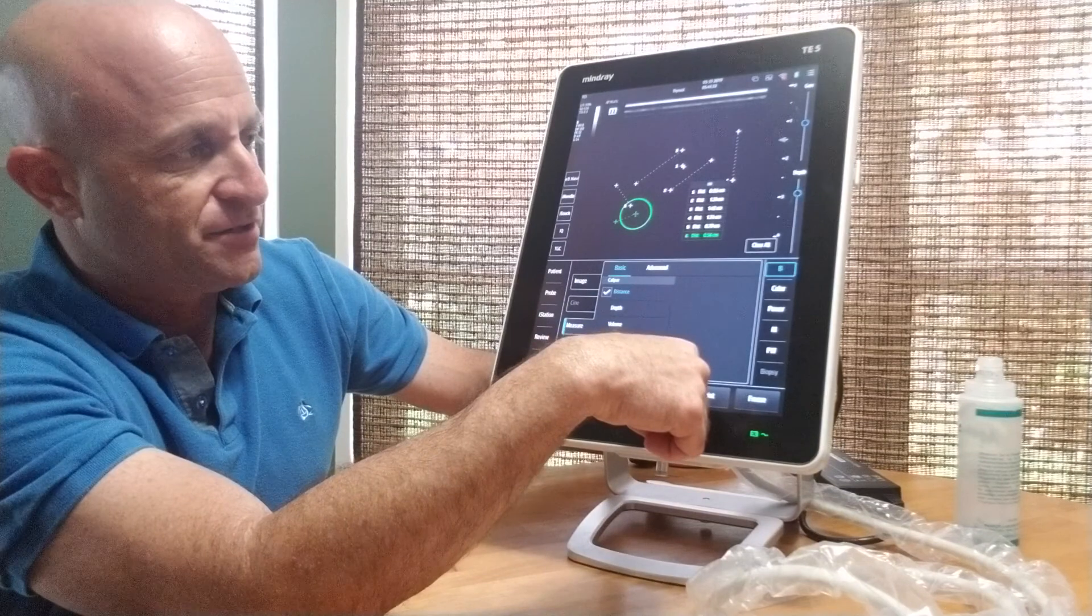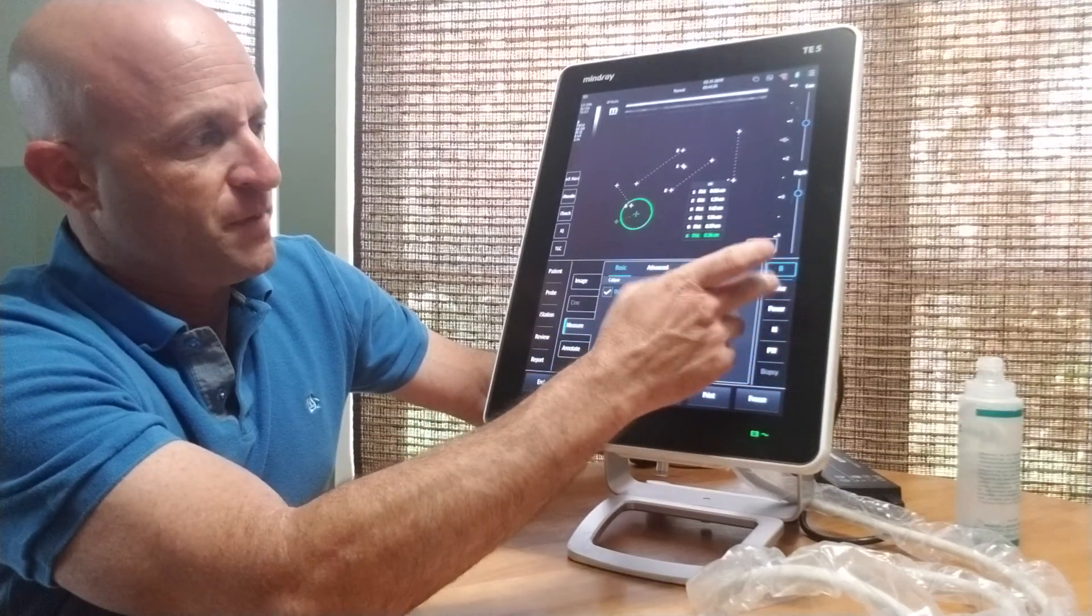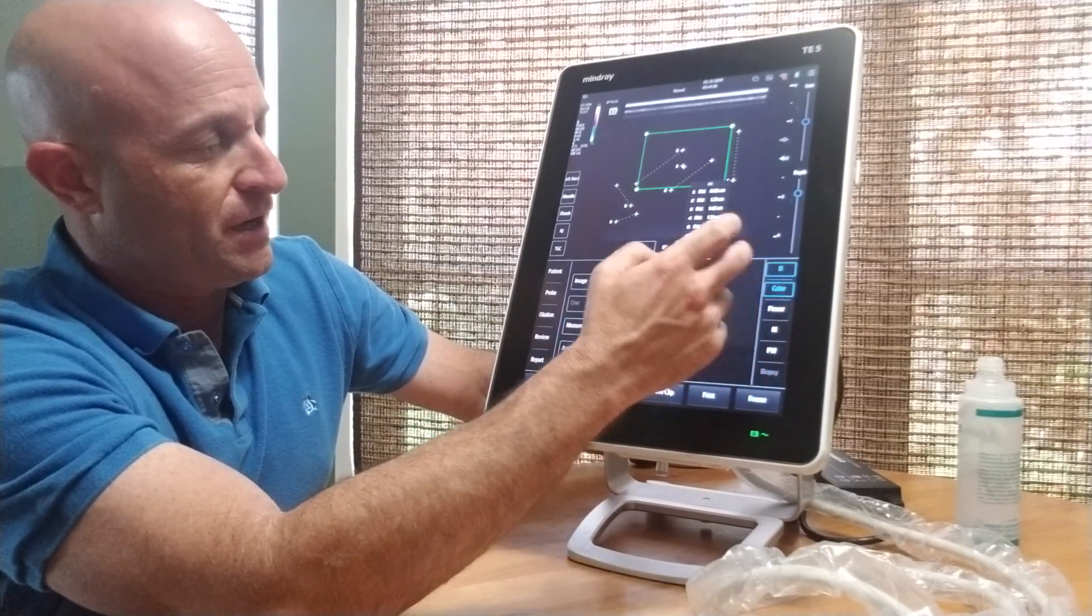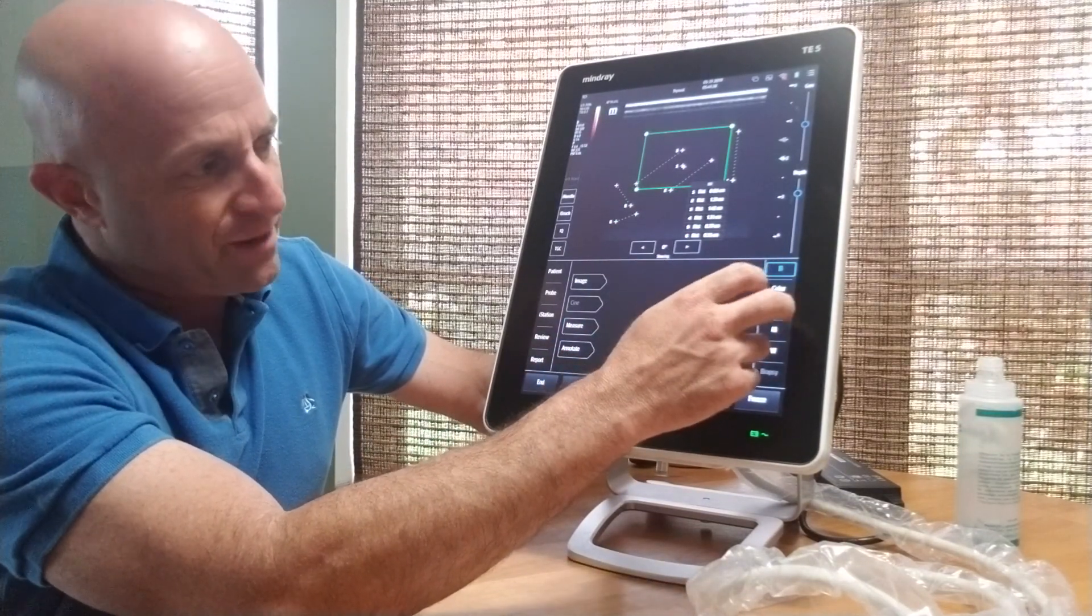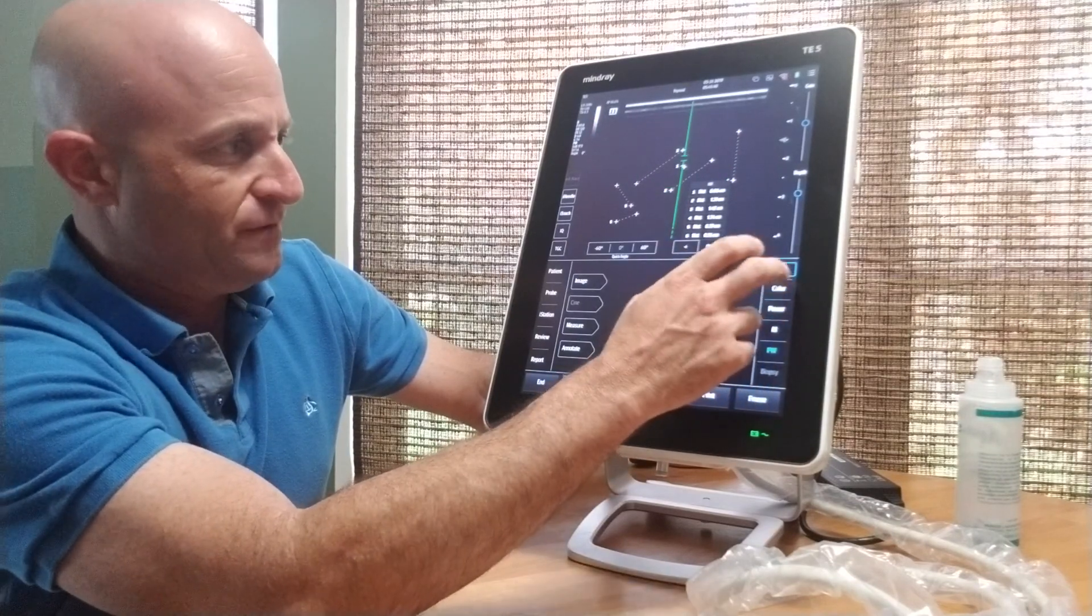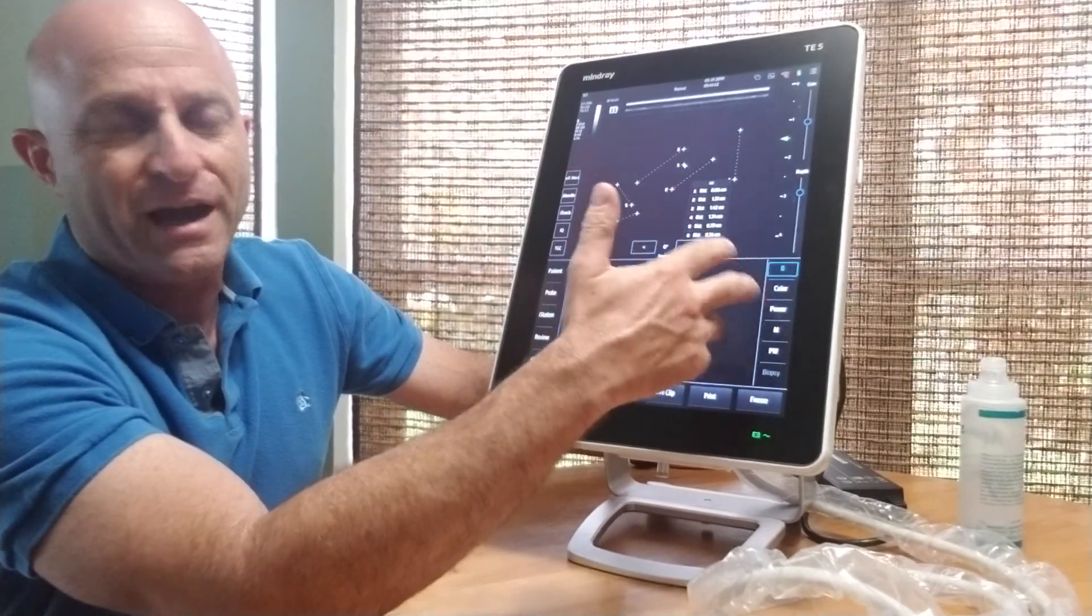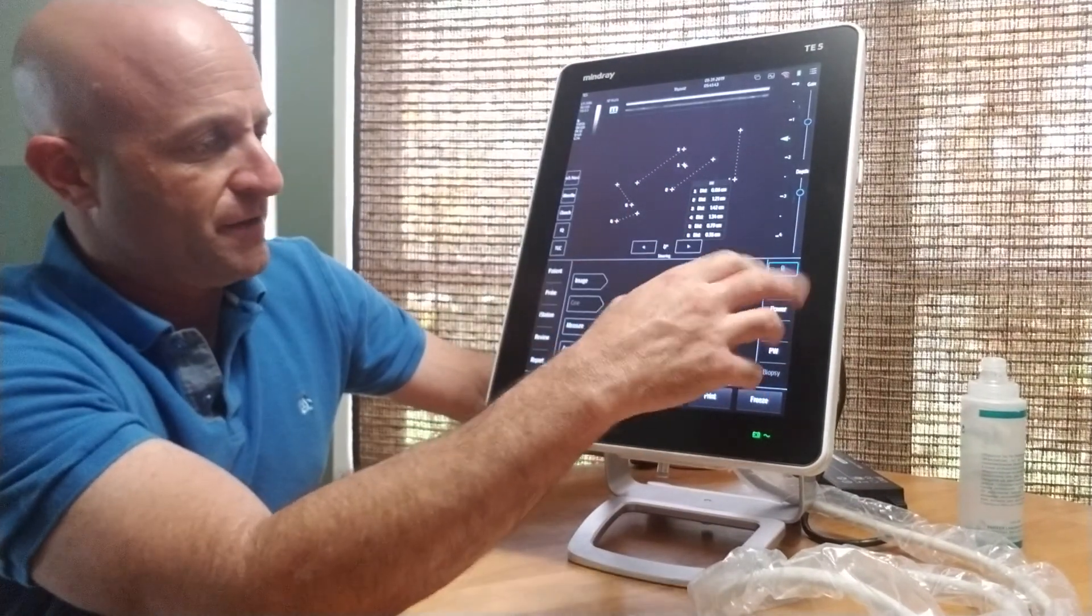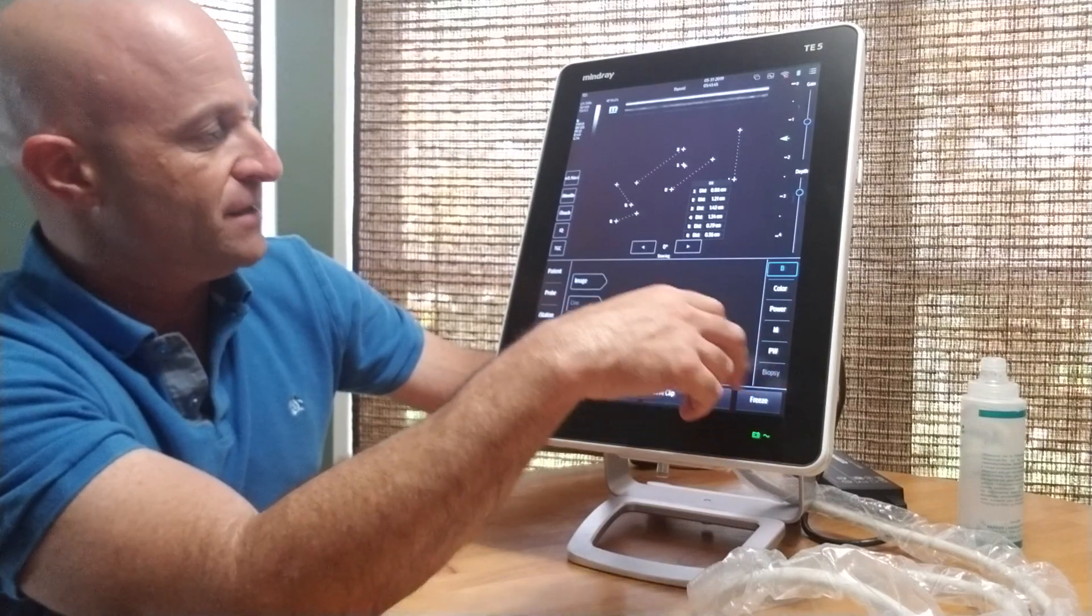You can save images and clips. We can go from B-mode to color to power Doppler to M-mode to pulse wave. There's a lot of nice functionality that's automatically built in.